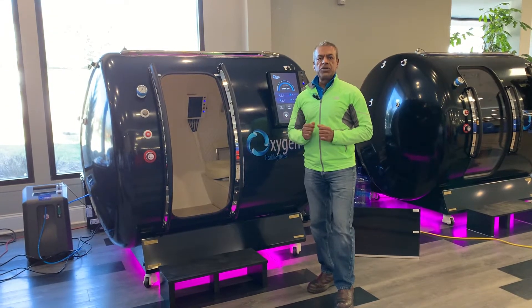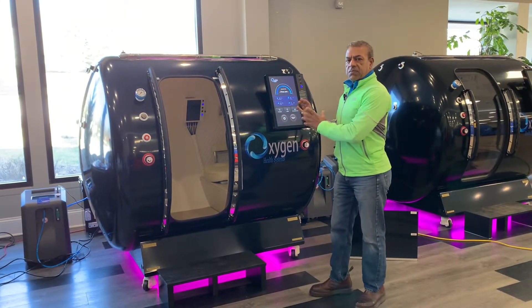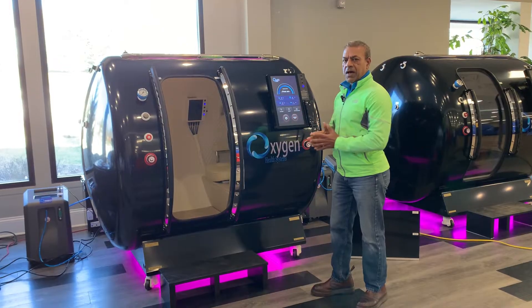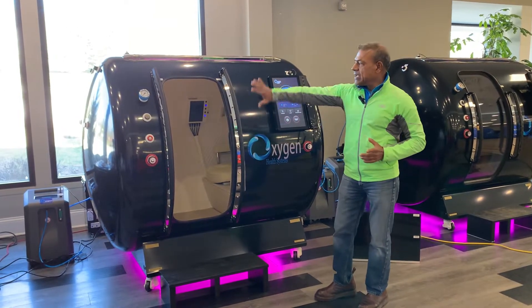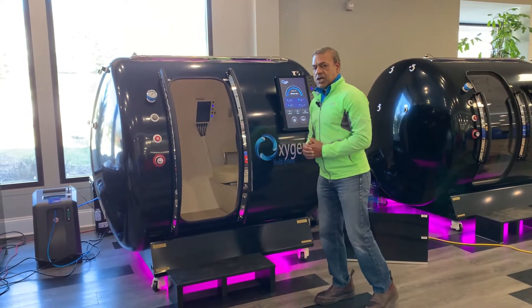Greetings folks! In this video we'll show you some of the highlights of this multi-place chamber that is capable of going up to 2.0 ATA. I'll start from the outside and then we'll move to inside the chamber.